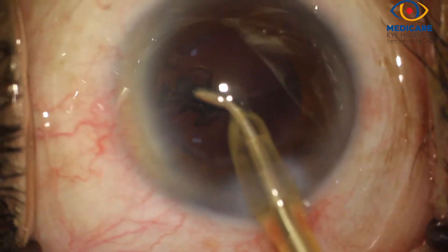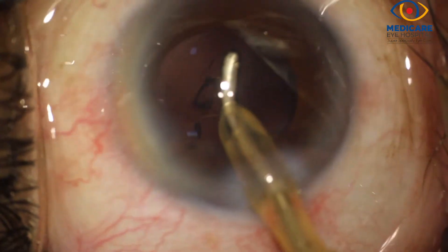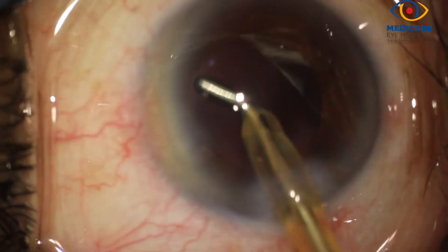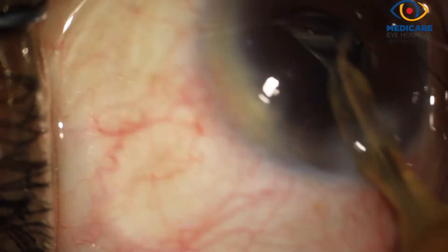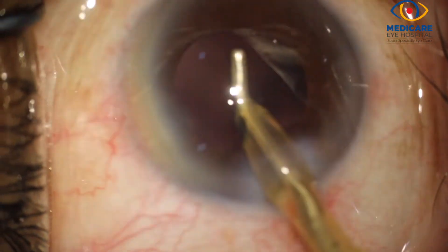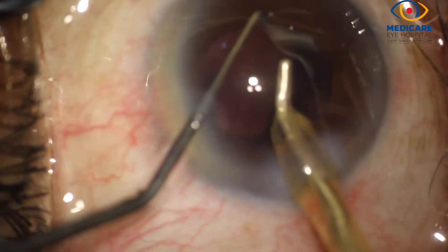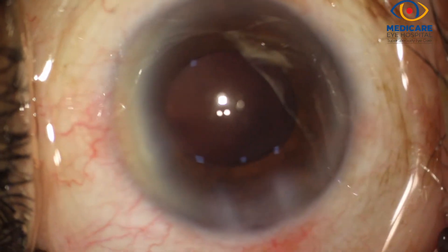The coaxial irrigation-aspiration bent cannula is now used to remove the residual cortical matter. Capsular polishing is then done to ensure complete removal of all the cortical fibers. The peripheral iris is tented up to look for any remaining cortex, as the pupil size is quite small here.